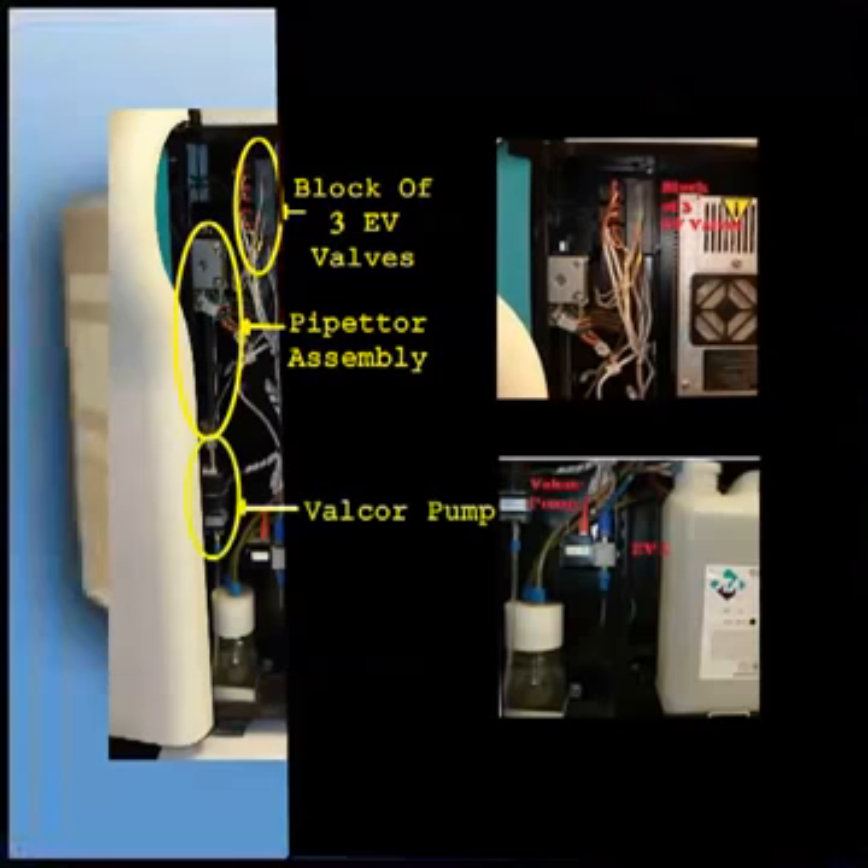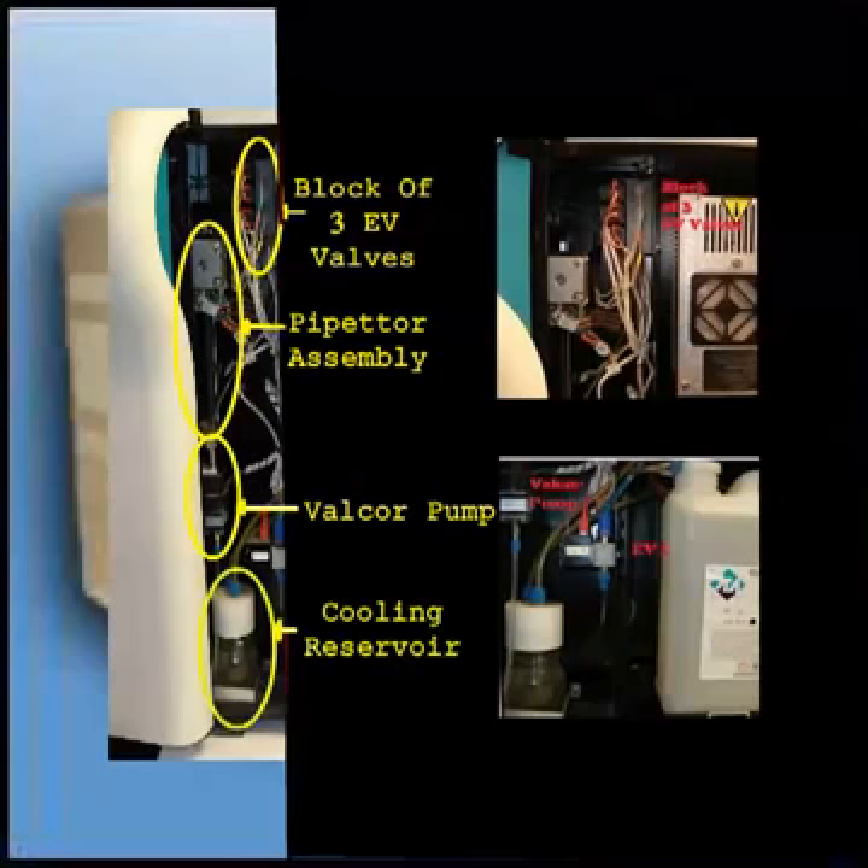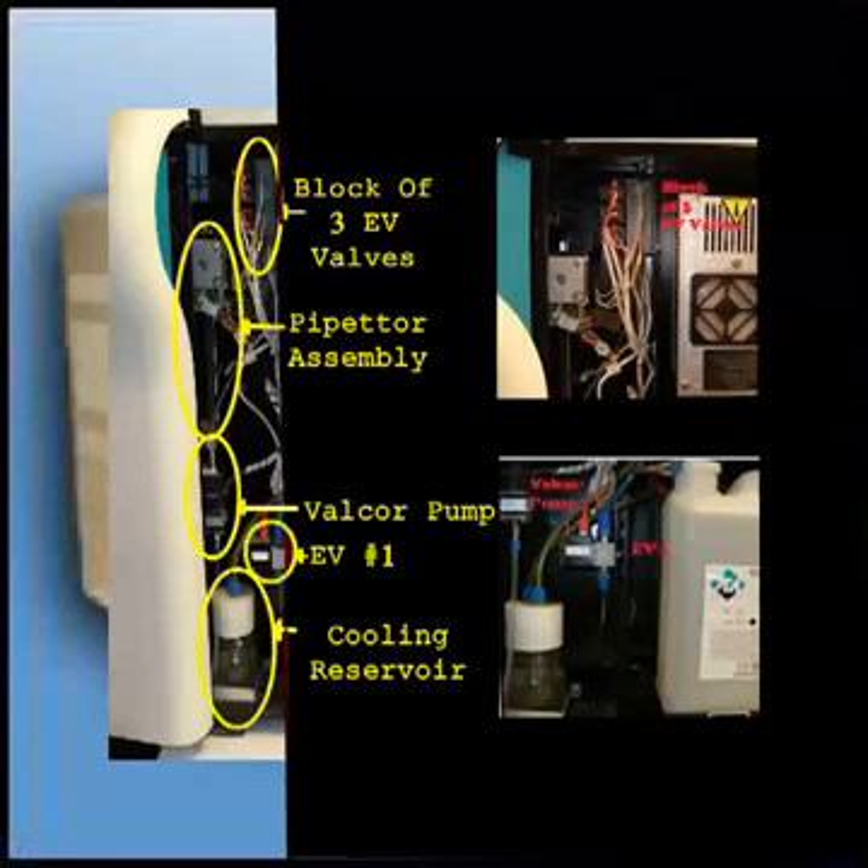Below that, you have a Valcor pump which pushes cleaning agent through the needles for washing. Note there should never be any air bubbles in the tubing between those assemblies. At the bottom of this section is the cooling reservoir bottle, which is used for cooling and heating of the product drawer and the measurement block.